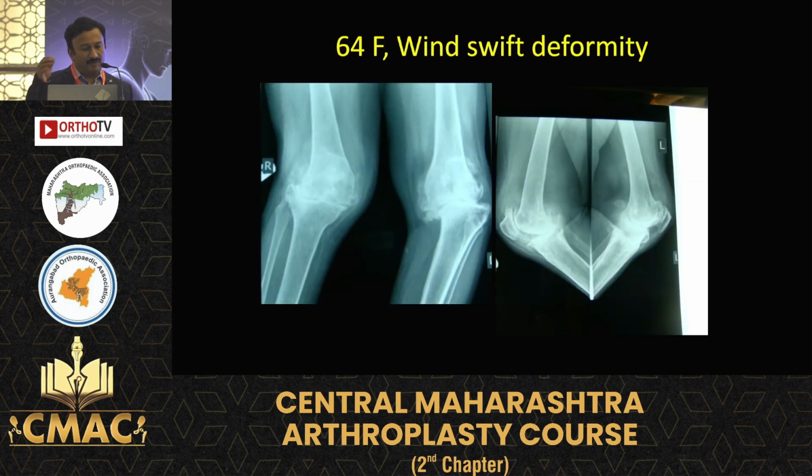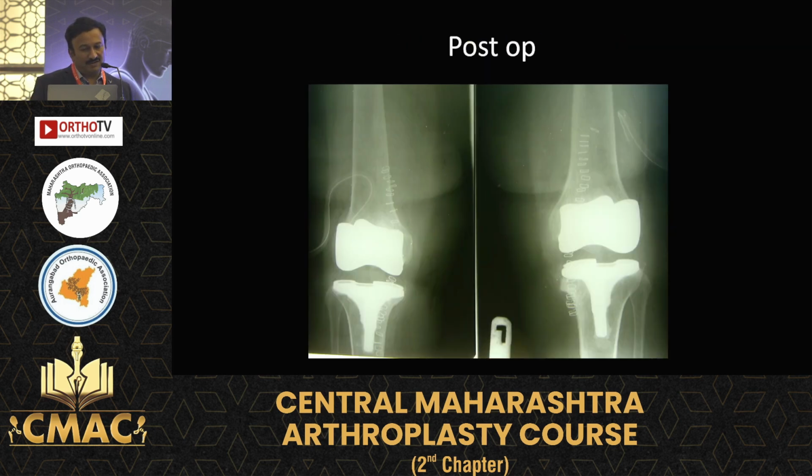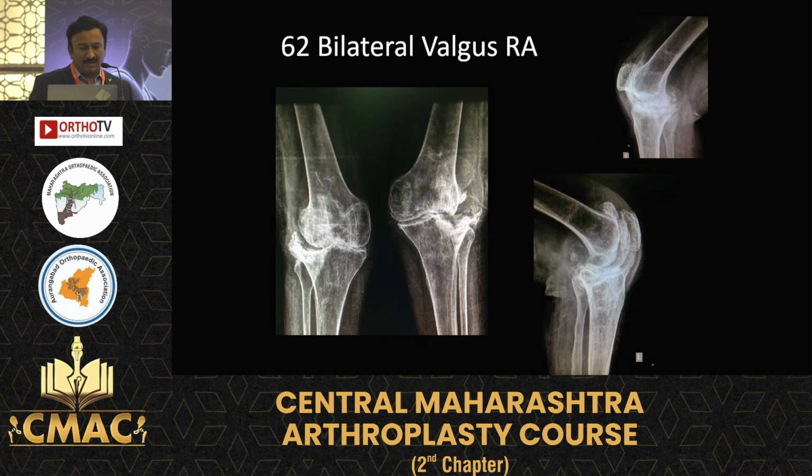Then severe deformity with the windswept deformity. In these cases also, you can manage very well and you can still get away with the primary implants. This I want to show you because they will look very nasty when the patient comes to your clinic. But if you do a sequential release, sizing very well, managing your gaps, you can get away very well with the primary implants.